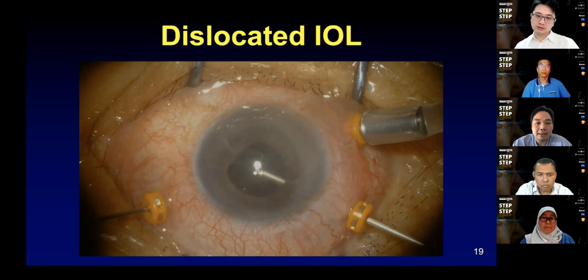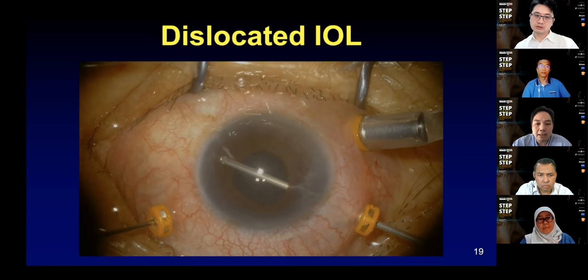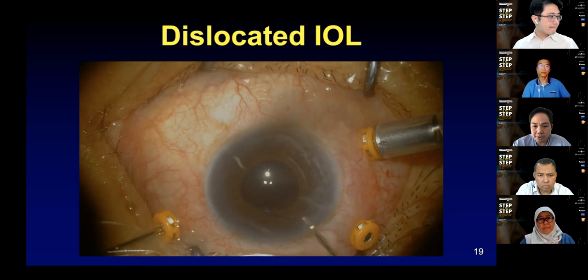So do an anterior vitrectomy. I think the surgeon before me had done a good job. There's not much vitreous there, but I just wanted to make sure to clear away all the triamcinolone. What I'm going to do now is first grab that haptic so you can exteriorize it. Then I open up my central wound. I use a 2.75 wound.